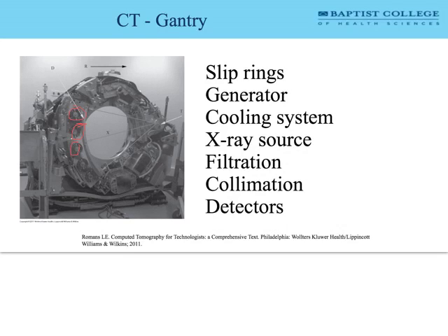Collimation. Strictly speaking, the collimators restrict the X-ray beam to specific areas and they reduce scatter radiation. So they will improve image contrast by reducing scatter. Any reduction in scatter radiation results in improvement of contrast. That's true for X-ray, that's true for CT, just on down the line.